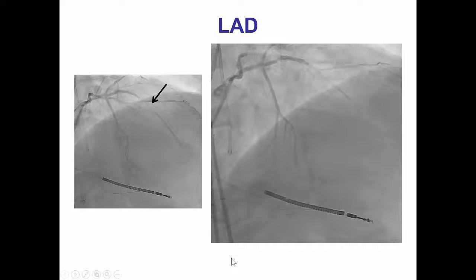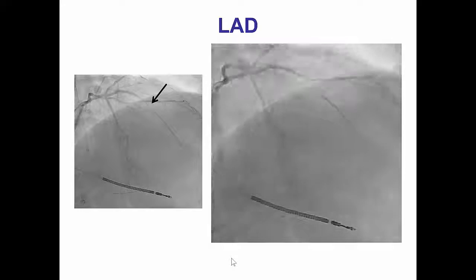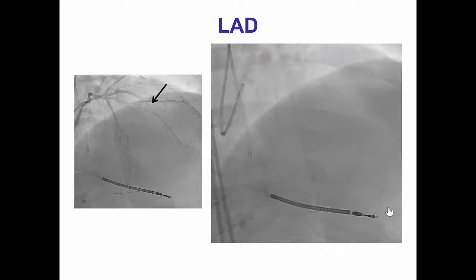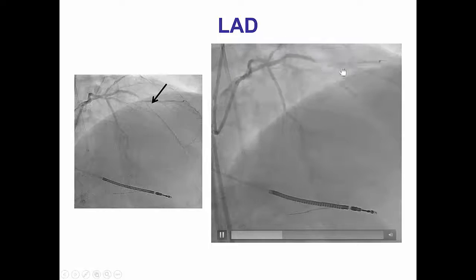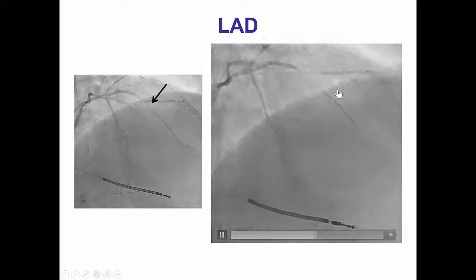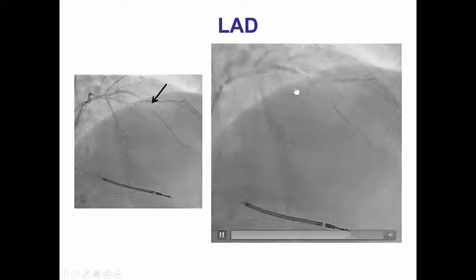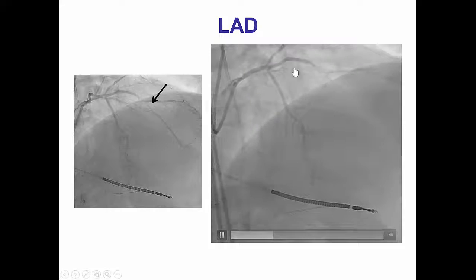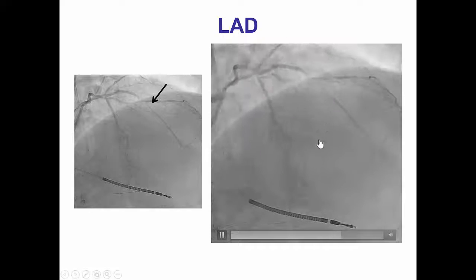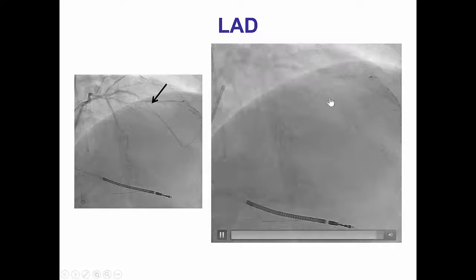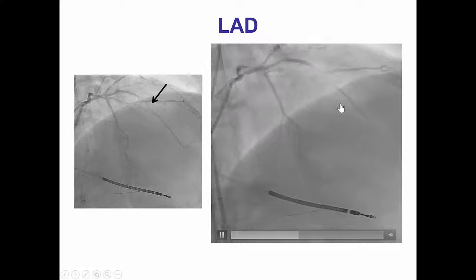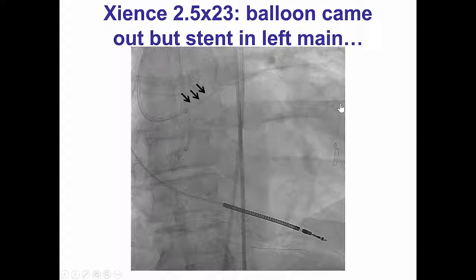Checking the donor vessel after the retrograde gear was removed demonstrated, however, a lesion that was worse than before in the mid-LAD, possibly due to injury from the retrograde equipment. Therefore, a decision was made to place a stent in the mid-LAD.